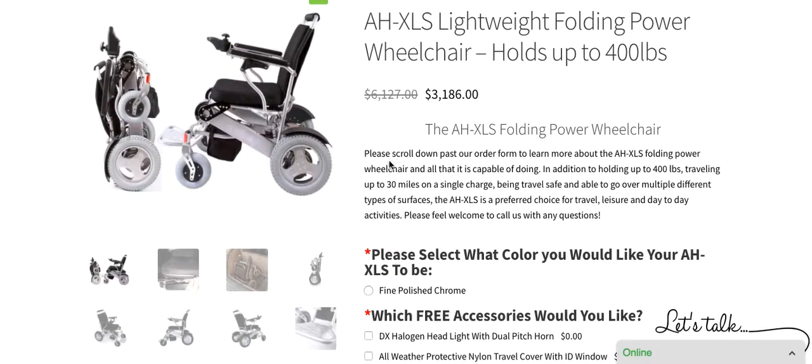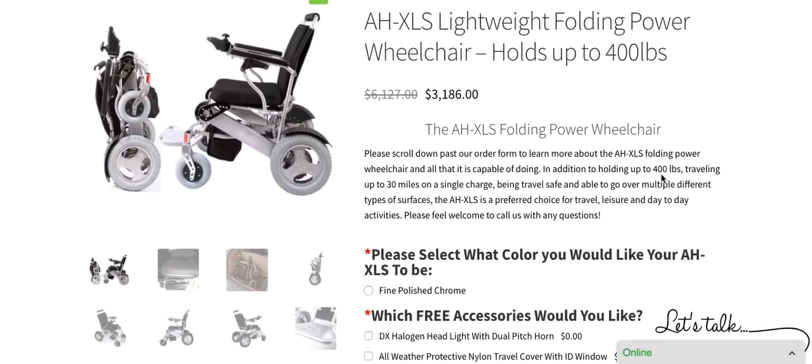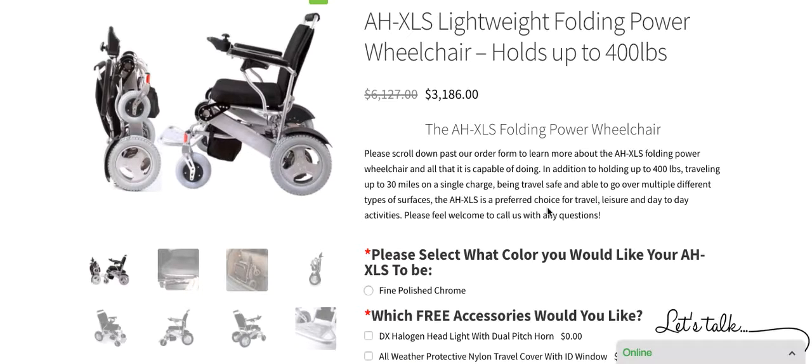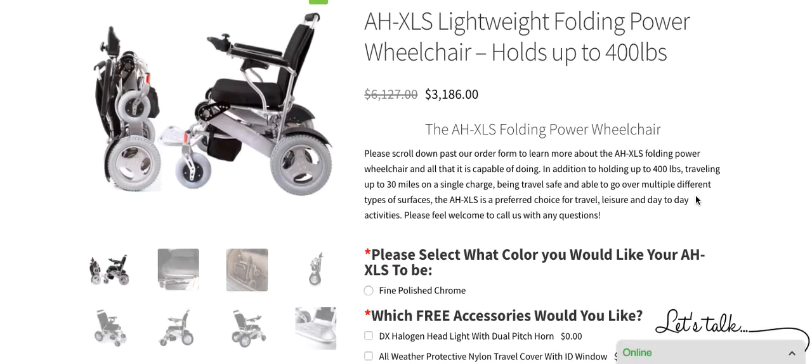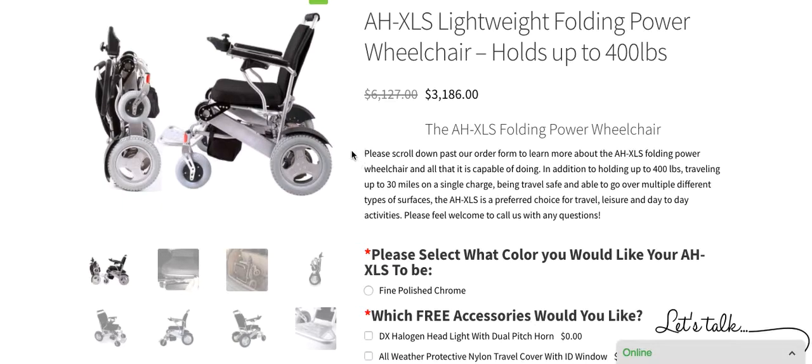A couple of key features you might notice is that this wheelchair is capable of holding up to 400 pounds, traveling up to 30 miles on a single charge. It is a travel-safe wheelchair, so it folds up and you can take it traveling with you on the plane, train, or cruise line. It has the ability to go over multiple different types of surfaces, and the AHXLS is very quickly becoming a preferred choice for travel, leisure, and day-to-day activities.